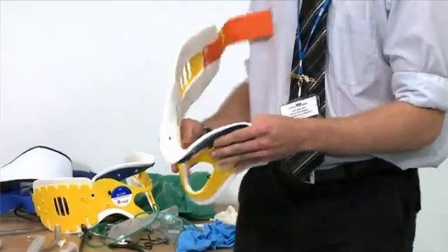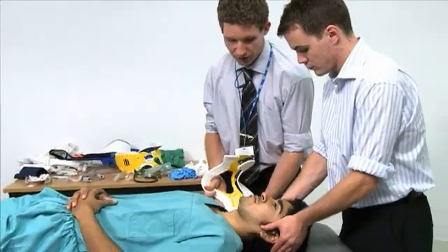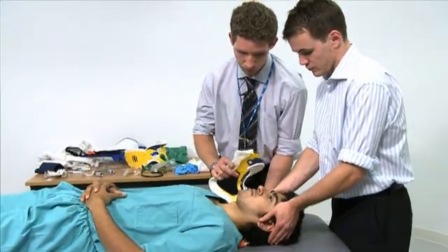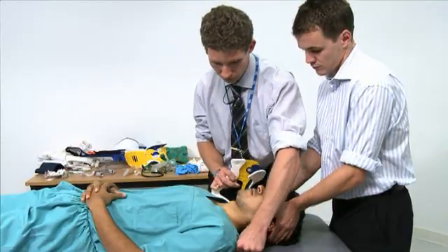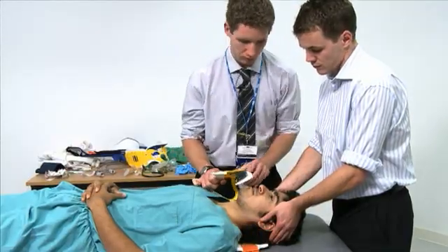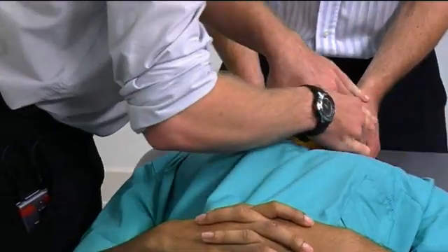With an appropriately sized collar, you insert it under the patient's neck and then secure it.